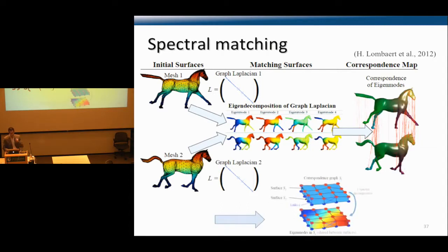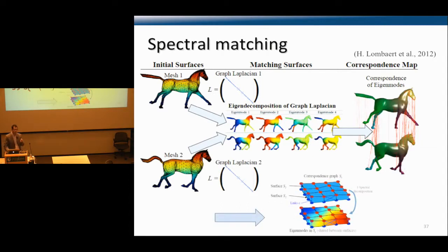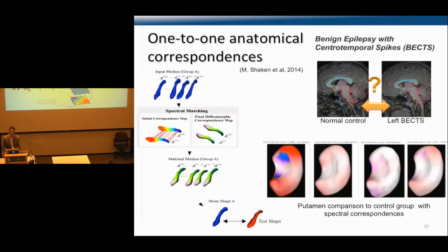And so once we have a one-to-one correspondence, that will enable us to have a diffeomorphic registration. So we're able to have an elastic warping between our diagnostic and the ultrasound imaging and compensate for respiratory deformation. And actually, we're in the process of transitioning to intraoperative registration.